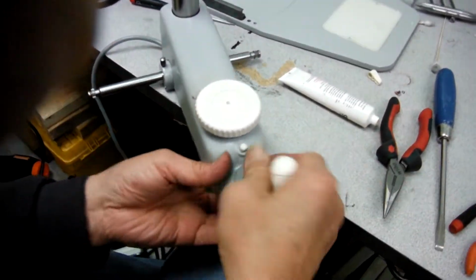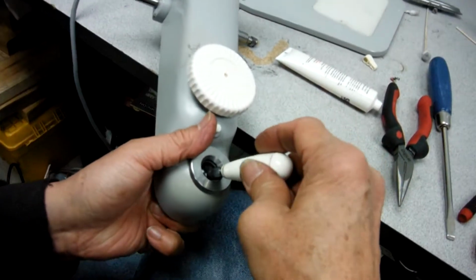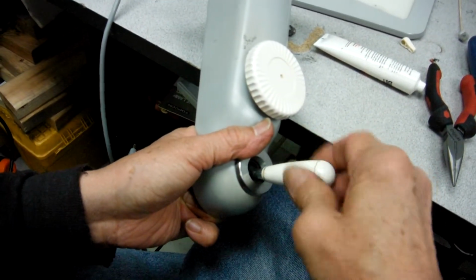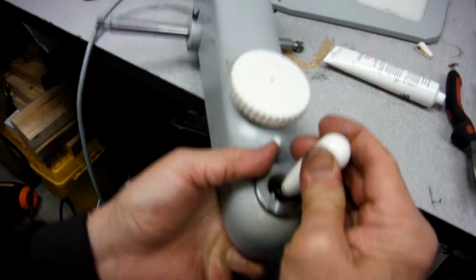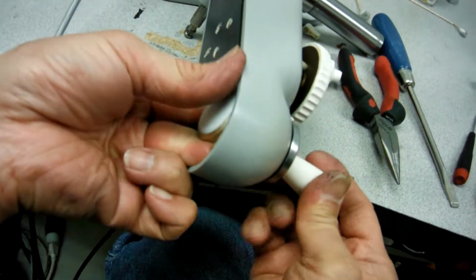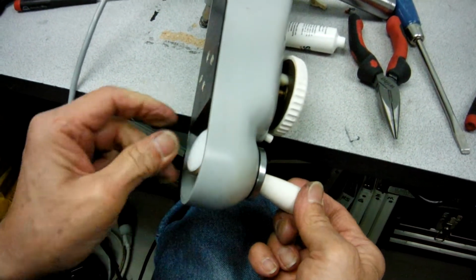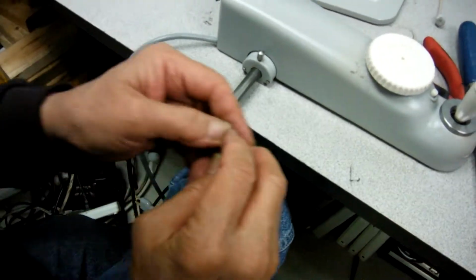And the last thing you do is put the joystick knob back in place. It's going to be screwed in there, so make sure you screw it in far enough, as tight as you can. And at the bottom you have to hold this one so you can screw the joystick back in place. And that's almost everything done.